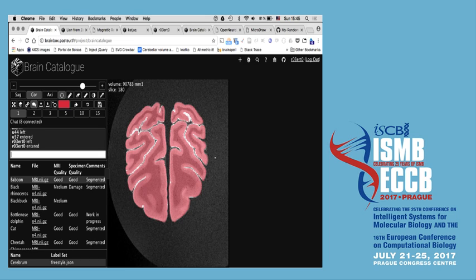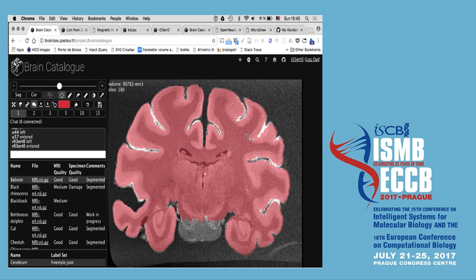So for example, I can use the show tool and show myself. I will be annotating. So I'm on the same slice, and you can see me there. So I can show myself things. And for example, I will now go to a different slice. I will take this thing better. And I can show like this.